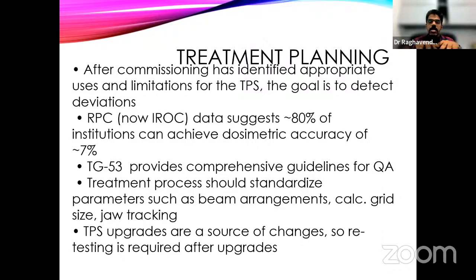So this is the reason everybody says I need a Monte Carlo dose algorithm, because at the level of commissioning itself the inaccuracies are less compared to the model or database system. But that doesn't mean that you don't have to measure. We need to measure, but only to verify whether model calculated values are accurate enough, or are they good when I measure them. Whatever my planning system gives by the end of the day should be delivered to the patients, right? So that is why we need testing for the planning system once we commission it.